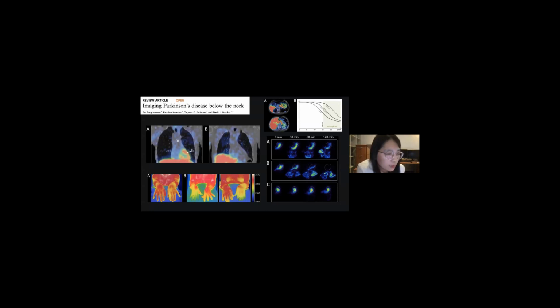In clinically diagnosed PD and in the prodromal disease phase, functional imaging tools using radioisotopes are important for elucidating the nature and chronology of peripheral pathology of PD. Dysphagia, gastric emptying, intestinal transit time, and anorectal dysfunction can also be quantified through the use of radiotracer and radiological imaging techniques.